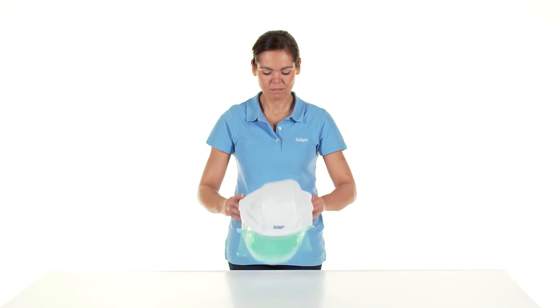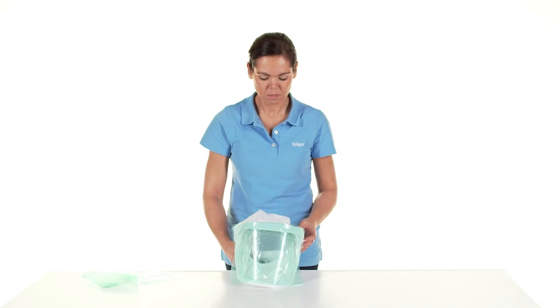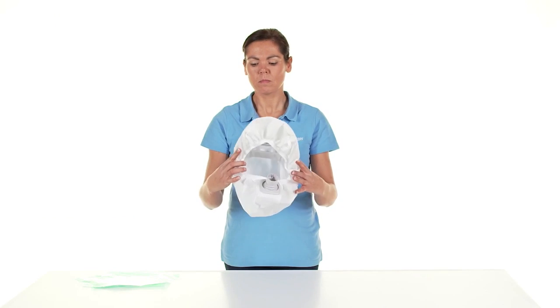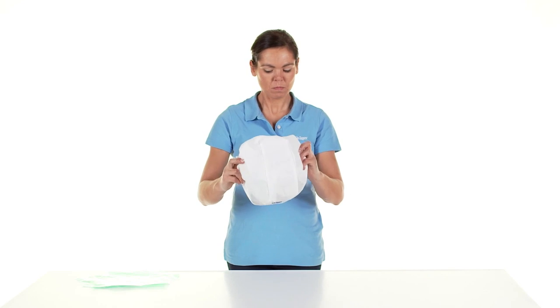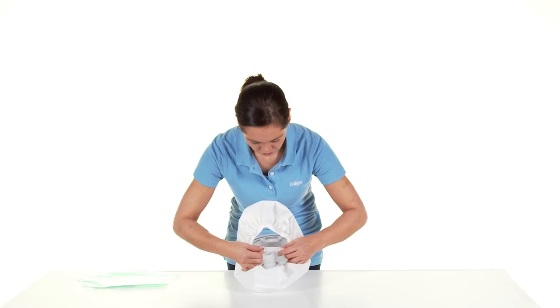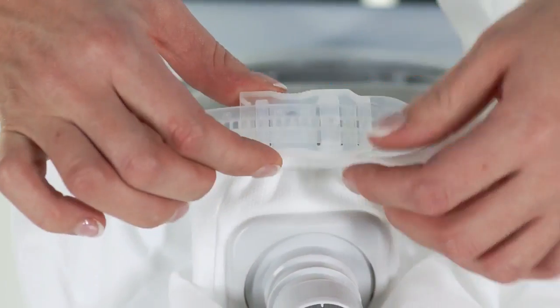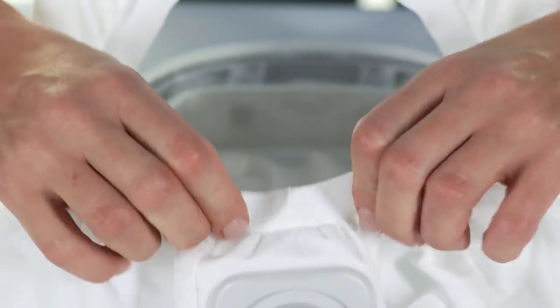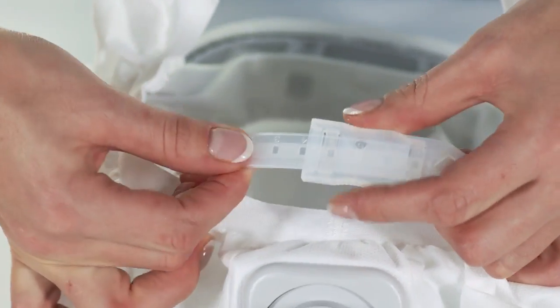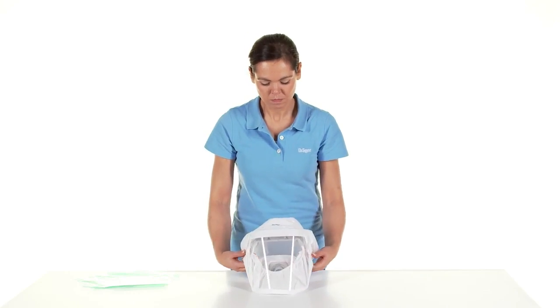Before first use, remove the protective film from the visor. Perform a visual inspection and function test before each use as well. Now adjust the support ring to your size using the quick adjustment system — press with your thumb and forefinger into the notches to help with the adjustment. The numbers correspond to the head circumference in centimeters. Five levels are available for adjusting the head height, with level 1 being the smallest and level 5 being the largest setting.